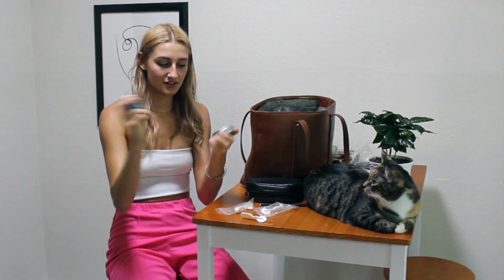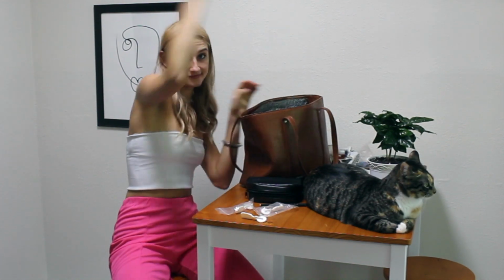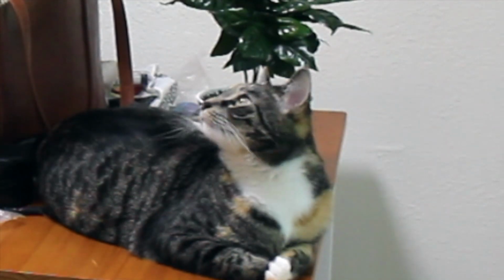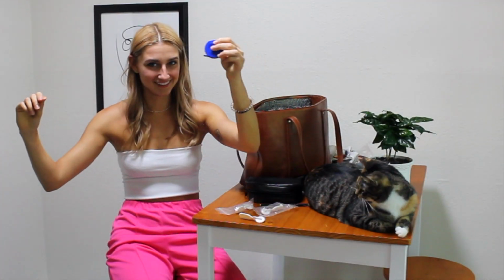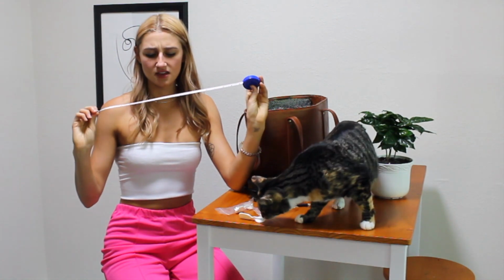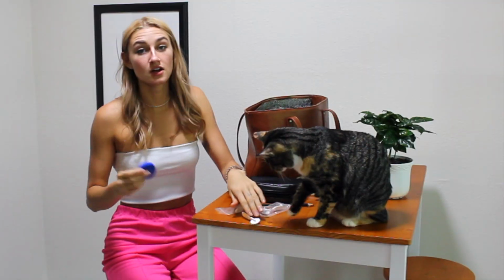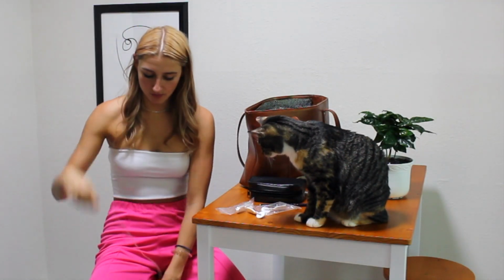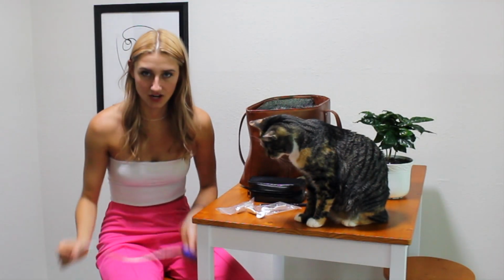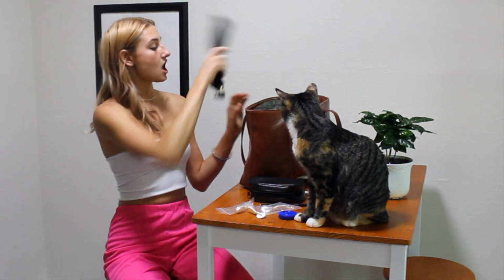We have some hand salve when your hands get crusty. Ooh, we have a measuring tape for orthopedic diagnosis, and I think we use this in neuro, maybe not. I haven't used it in neuro, just kidding. Orthopedic diagnosis to measure different limbs, different circumferences of muscles and stuff, and look for atrophy.